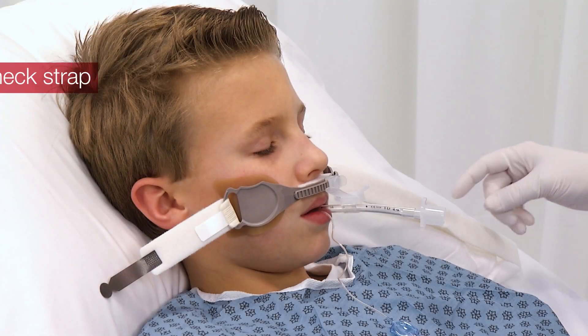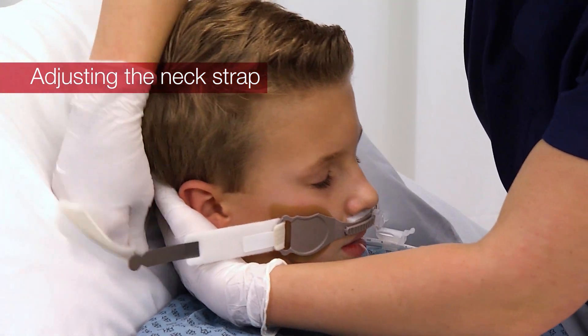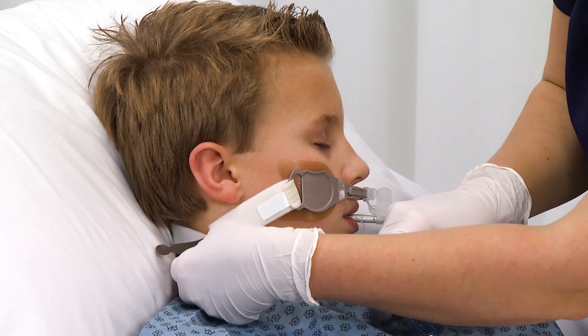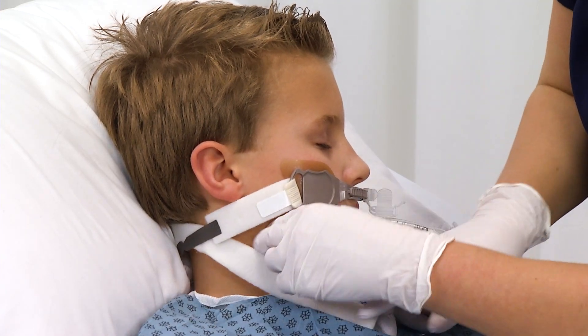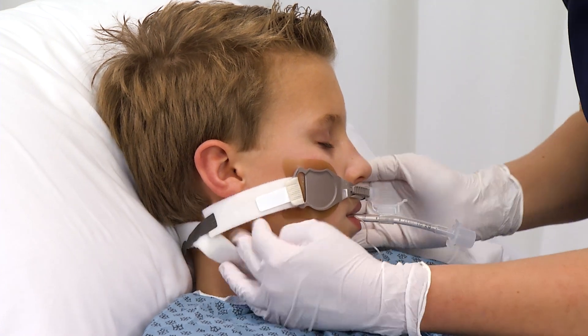For greater comfort and security, adjust the neck strap at the gray tab. Do not over-tighten. Allow two fingers width between the strap and the back of the patient's head.